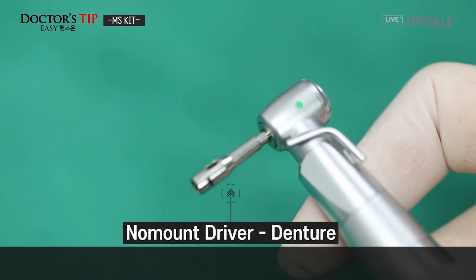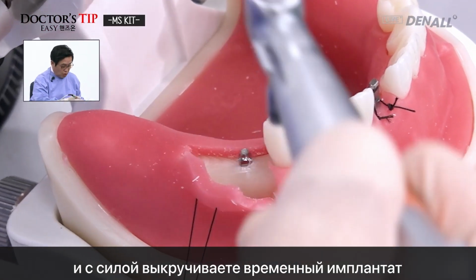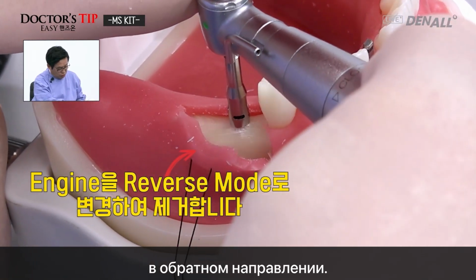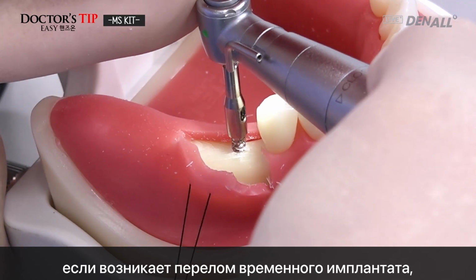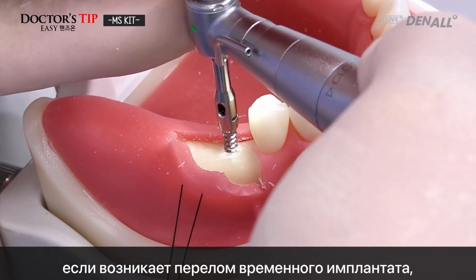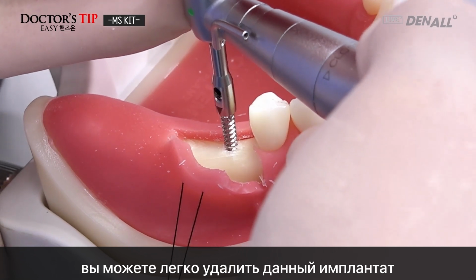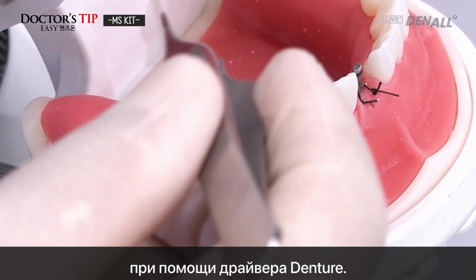You connect, and you have a hexagonal rod on the provisional bottom side. So you push this in the reverse mode, then it can be easily removed. So while using a provisional, if there is a fracture, then using this denture type, you can easily remove the fixture.